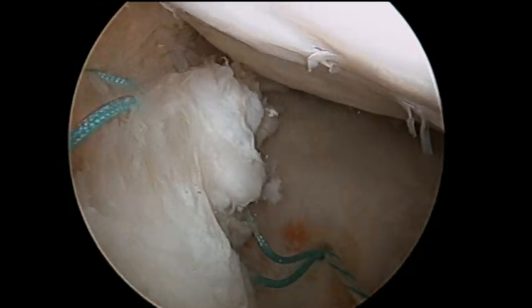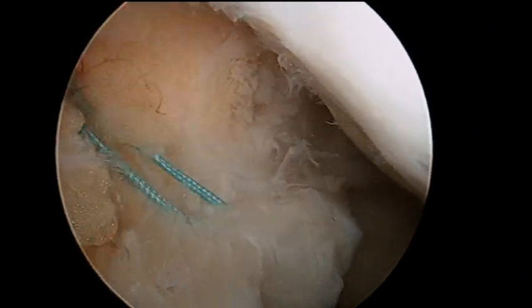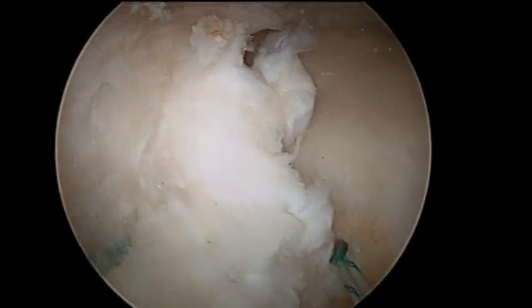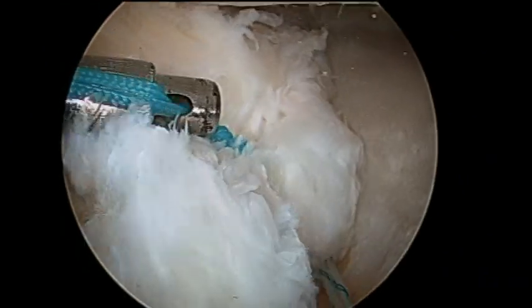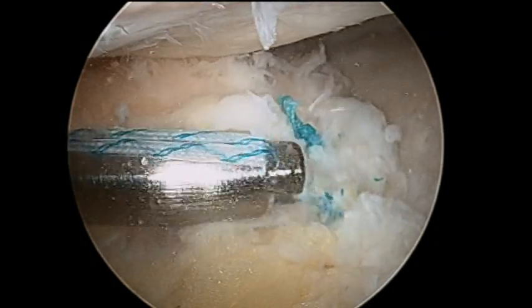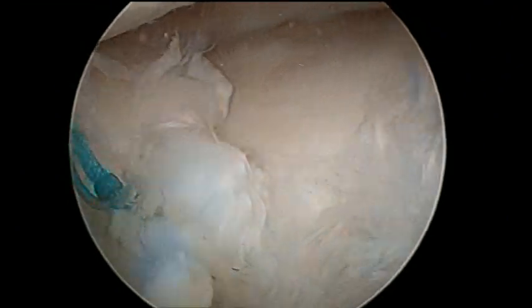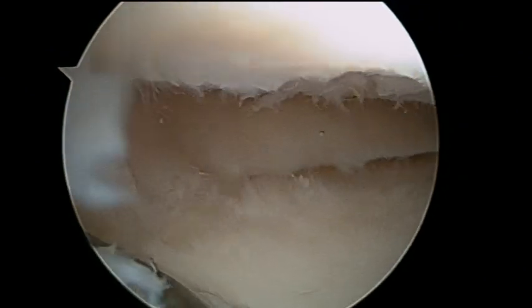Once both ends of the thread are passed through the anterior horn of the lateral meniscus, a fingertip pincer is employed to avoid tissue interposition. A knot pusher is employed to finish the suture. The second knot is performed in the same way as the first one. After the suture is performed, the stability of the reinsertion is checked with the aid of a probe.